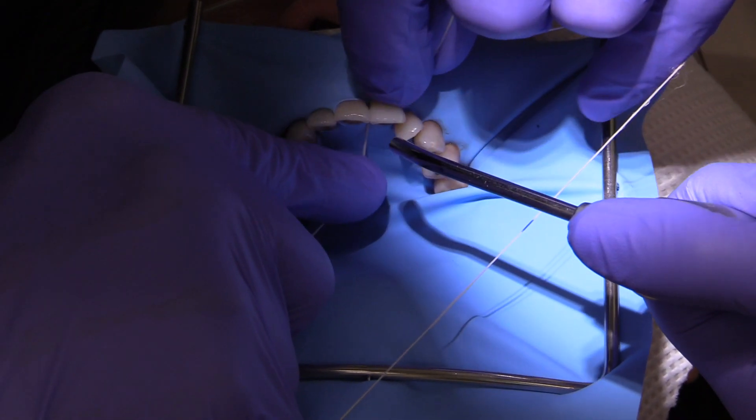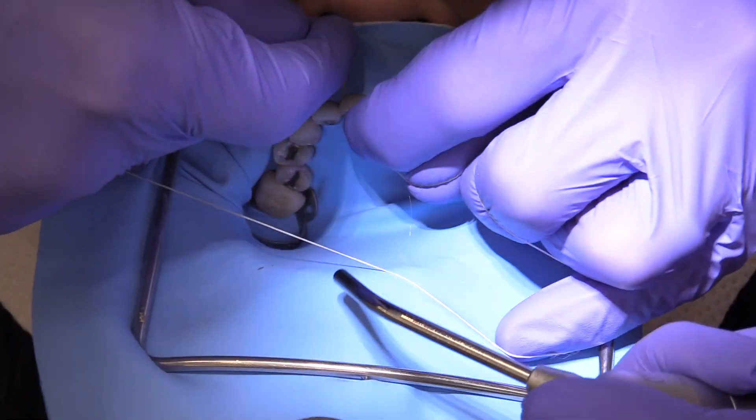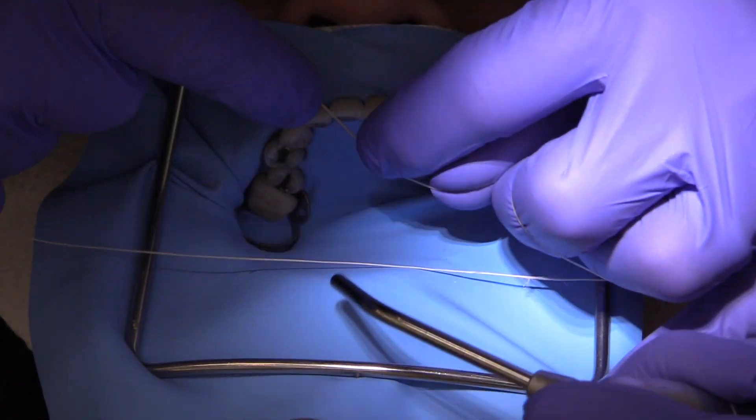With the rubber dam gingival to the contact area already, you may be wondering why am I continuing to floss? And that is really to invert the rubber dam.